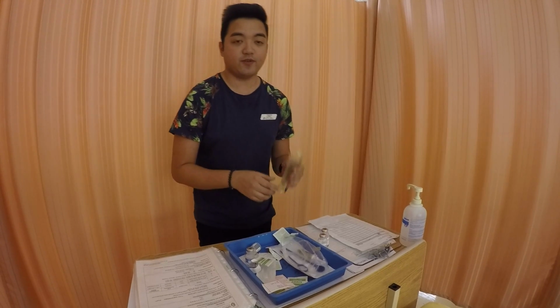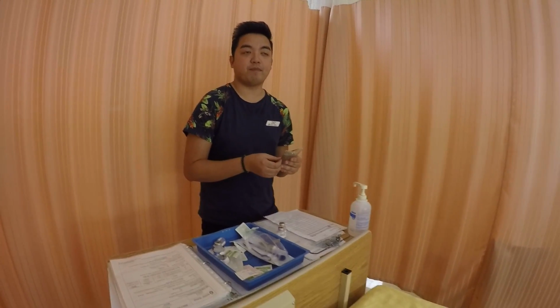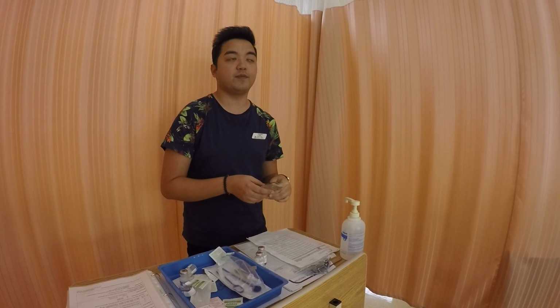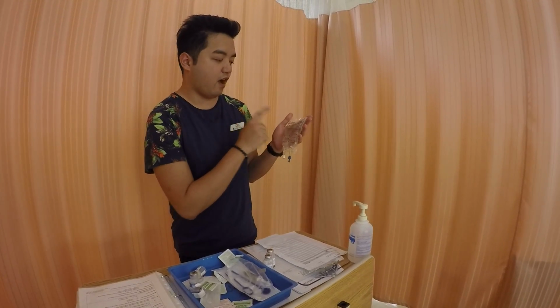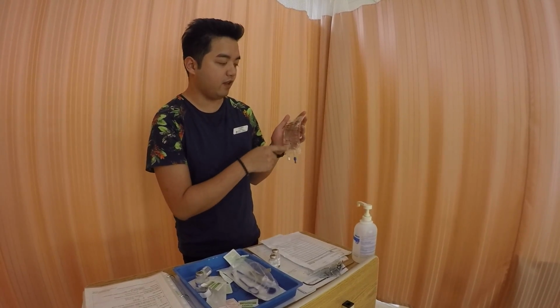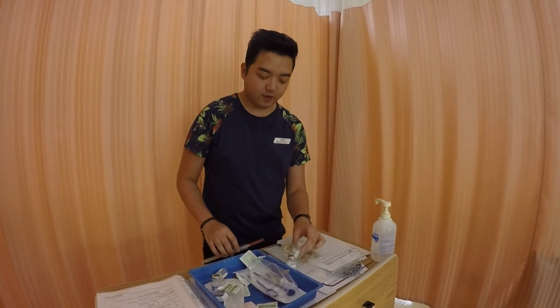Plus, also, as we all know, normal saline has the closest composition to our body, and then also the patient is running the normal saline as the primary line. Okay, so next thing to do is to just make sure that the secondary bag is not expired. There's no crystallization. The consistency is clear. Okay, and then now we're ready.